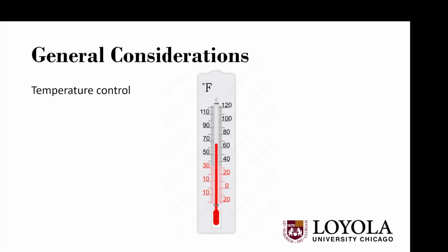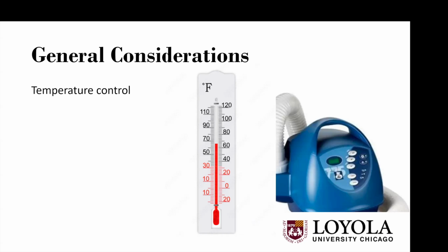The most common and most effective piece of equipment is your bear hugger, or warm air blowing equipment. Most of the times we use an underbody bear hugger, and we put it on before the patient is sent for, and we do not increase the temperature in the room, but only use the underbody bear hugger, and we turn it on to the highest temperature until the patient arrives.